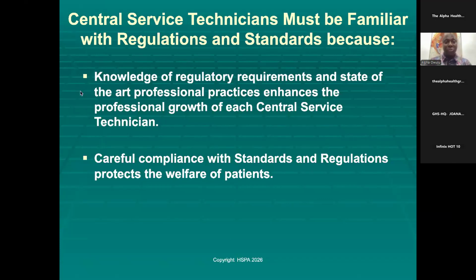And so if they don't know this, right, they are bringing their clothes from the house into the department, sharing the bacteria on the instrument. They don't wear gloves, right? They don't do washing, wash out, right? You have somebody having their eyelashes all over the place. You have their nails, artificial nails, and all that, right?